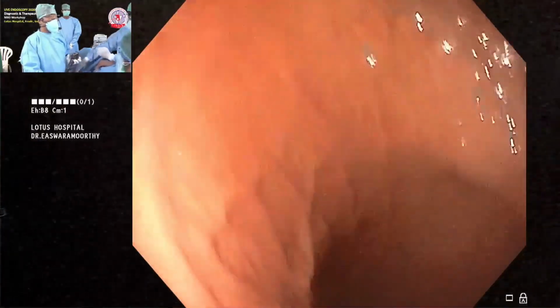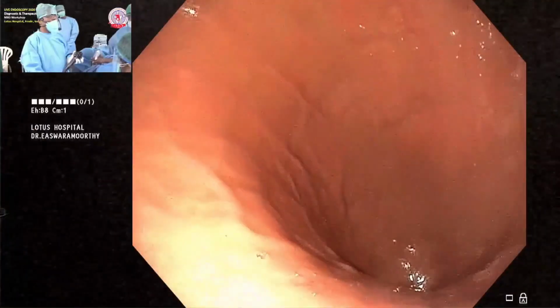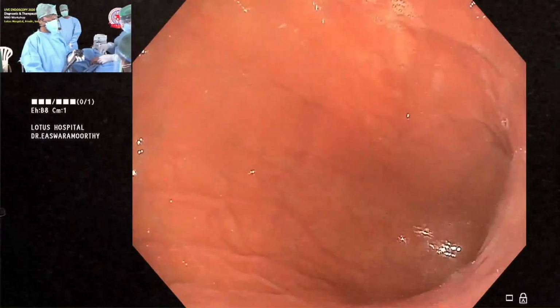As soon as you go in, if there is any fluid, you suck, of course. Distend the stomach enough to have a comfortable patient. Then push the scope, number 1. Turn the scope clockwise, number 2. And big wheel slightly towards you.